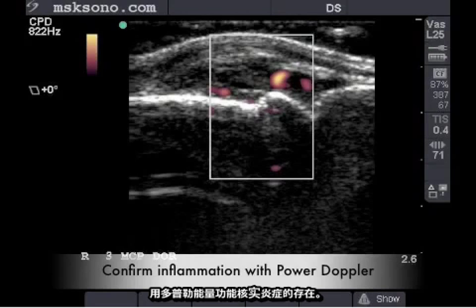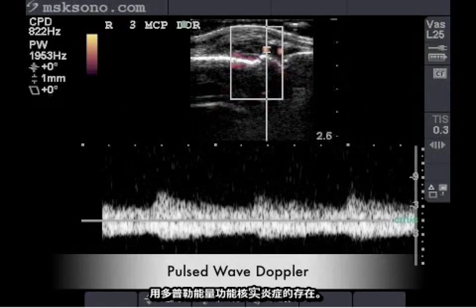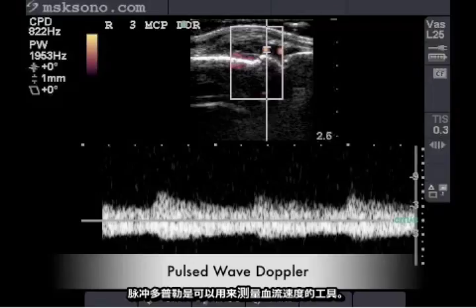Confirm inflammatory conditions with power Doppler. Pulsed wave Doppler is a tool that measures the velocity of blood flow.